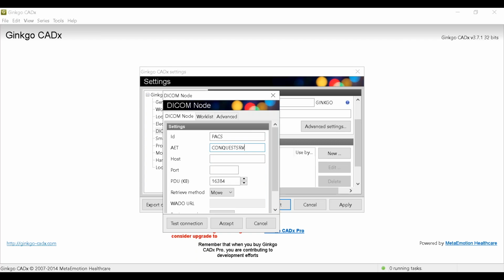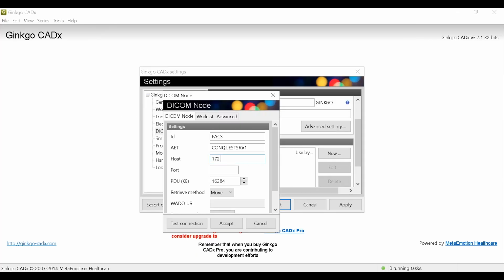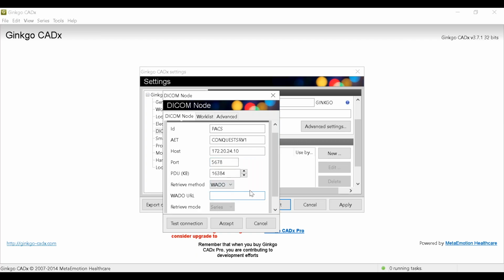ConQuest SRV1, if you remember correctly, not SVR, SRV1. If you remember the host, 172. You can go back over here, 20.24.10. That's this machine. Port number, remember we did 5678, not 2221. Who's living in 2221? Ginkgo is, right? And we're onesies. No, you can't use that. So notice here we've got some other things. We've got a URL. Yeah, you can do this over the web. This is a node, not a server.